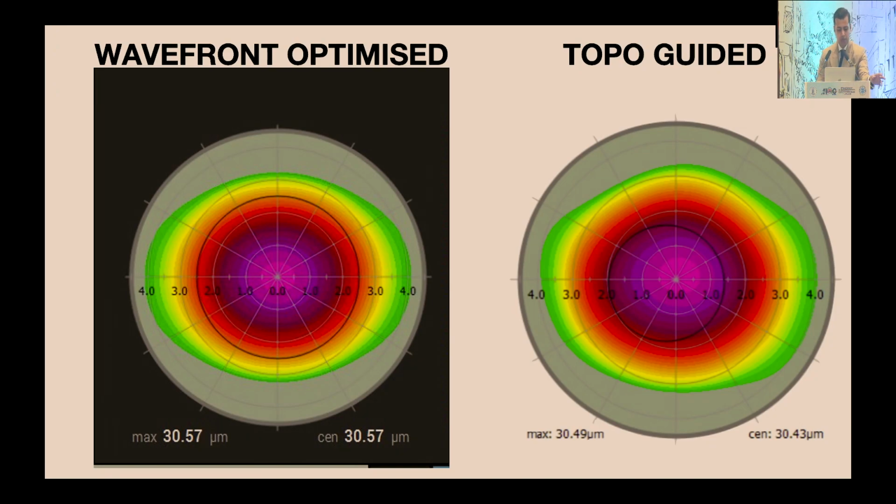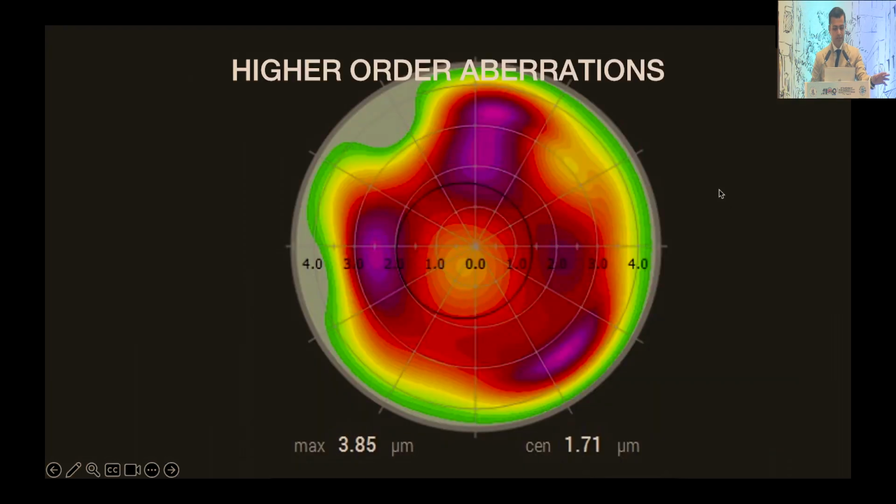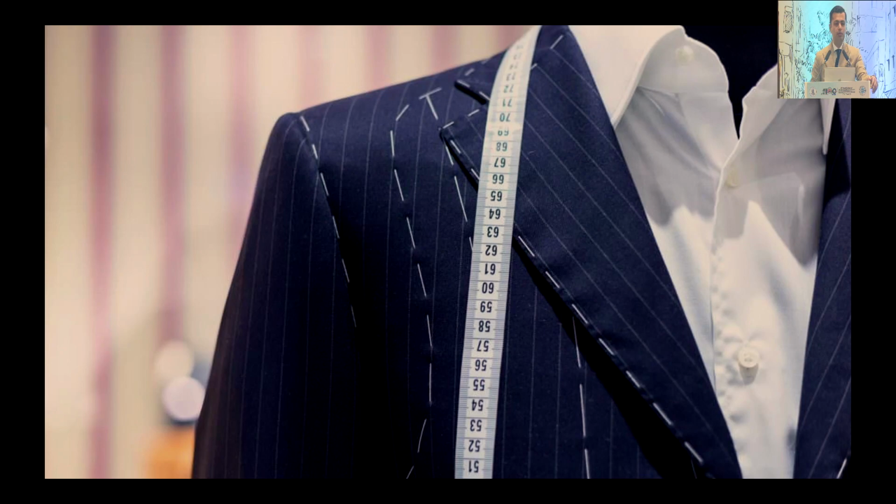So in this same patient, if you notice, this was the treatment. If I were to do a simple LASIK or a lenticule or whatnot, it would be an optimized treatment. Versus if I do a topo-guided treatment, the difference is this. Apart from removing the numbers, it's also going to shave your cornea in certain places a little more and a little less, so as to make an irregular cornea better. Even in a regular, normal, pristine virgin eye, it will make it better, so that your vision becomes better.